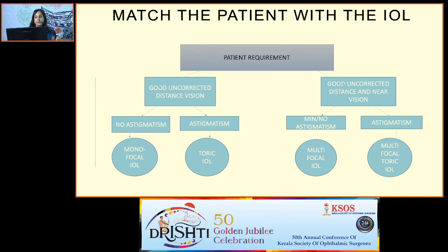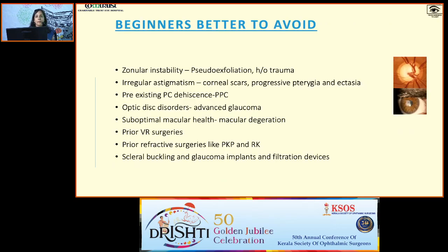Of course, you can also go for a multifocal toric IOL if the patient can afford it, which in our scenario, a lot of patients are coming forward who are looking to optimize their distance and near vision both, be completely spectacle free. And all the phacosurgeons who are just moving on or transitioning from monofocals to toric, I would suggest that you better avoid, at least in the beginning few, say about 50 cases, until you get your hands steady, to avoid these particular conditions.